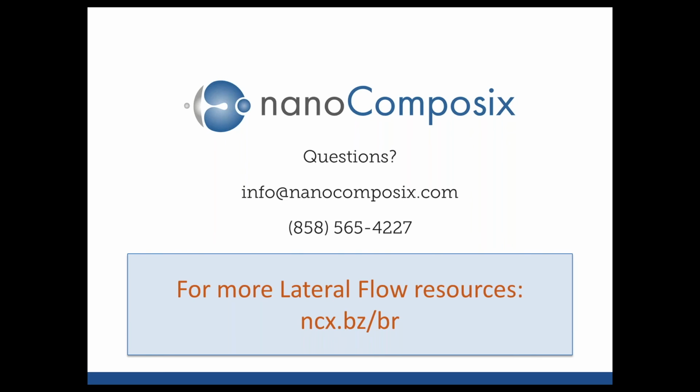Okay, we also have a question from Ben. Which particle gives rise to the blue signal on the test line? The nanoshells have a blue signal, and that's really due to the physics of plasmonics. The reason gold particles are used is that gold and silver particles have really unusual optical properties at the nanoscale. By changing the size or shape, you can change their optical properties. For 40 nanometer gold, it's a very efficient absorber in the blue and green regions of the spectrum, which makes the particles appear red.